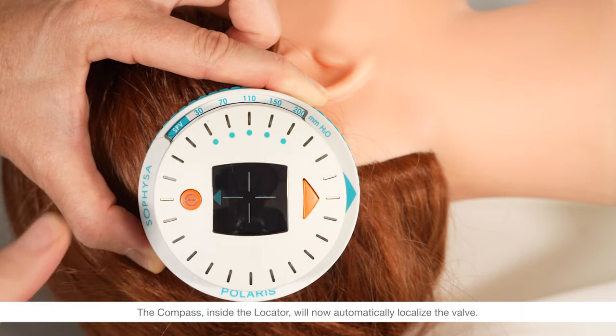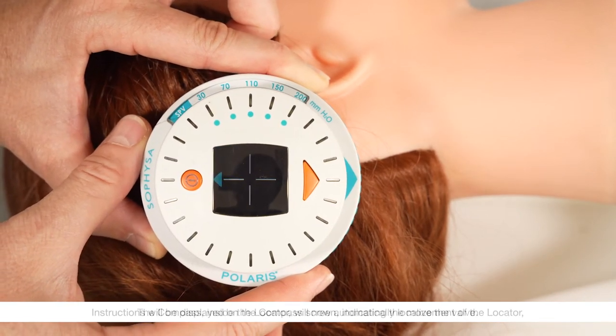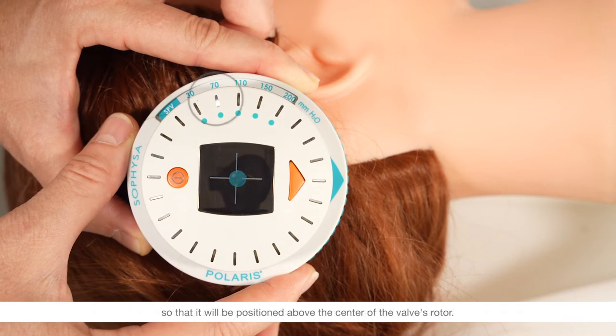The compass inside the locator will now automatically localize the valve. Instructions will be displayed on the compass screen indicating the movement of the locator so that it will be positioned above the center of the valve's rotor. When the center is close, a dot will appear on the screen. Move the locator until this dot is centered in the middle of the target. Now the instruments are centered properly above the implanted valve. Here it is 70 millimeters of water.